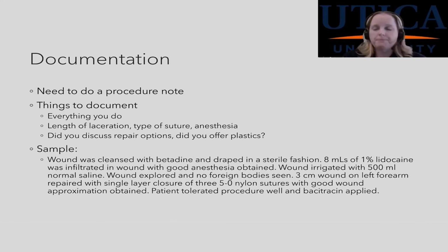So documentation. Anytime you're doing a procedure, your documentation is very, very important, because this is how you're going to be billing for your services. So you need to do a procedure note. How do you document this? You want to document every single thing you do.